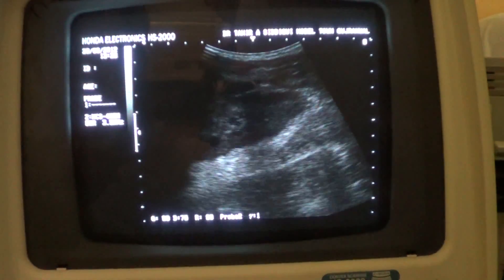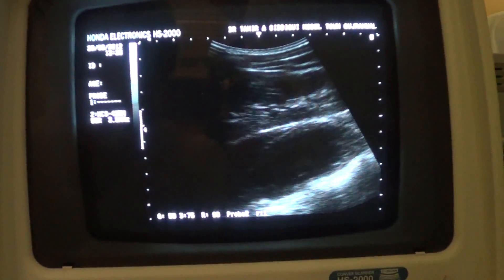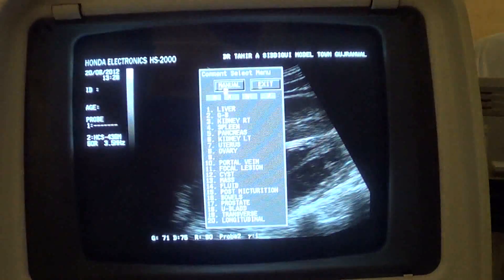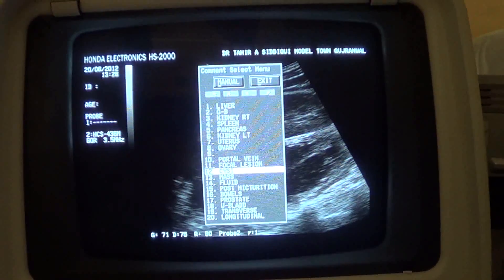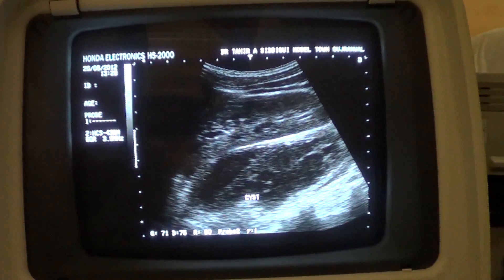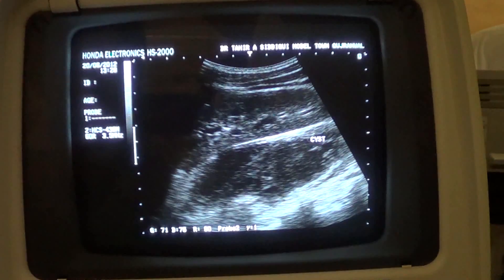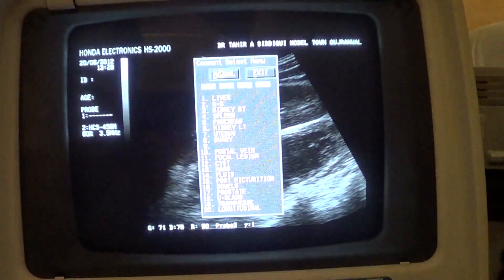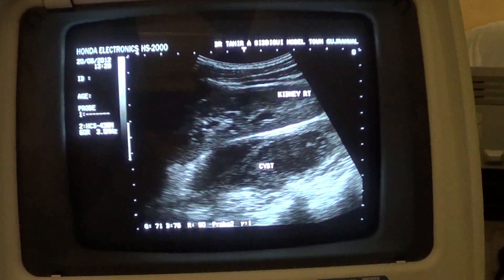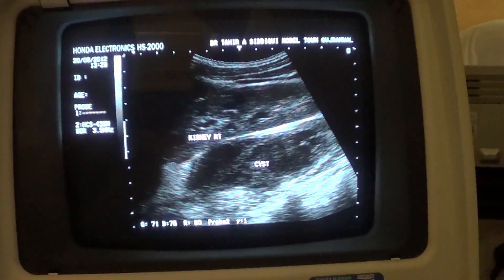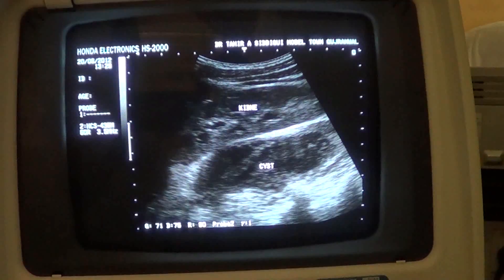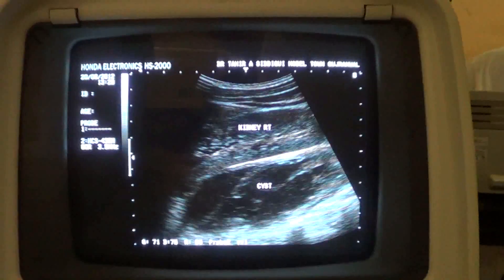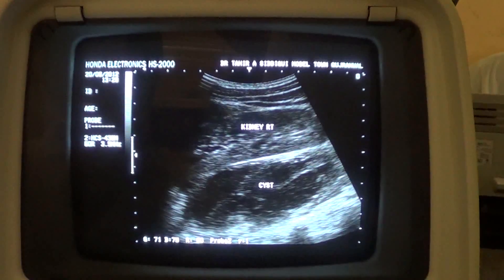You can see that the kidney is gliding over this cystic area, which remains stationary — it is not moving at all — whereas you can see that the right kidney is moving. This is the longitudinal section, and you can see that the right kidney is gliding over the cystic area, over the psoas abscess.